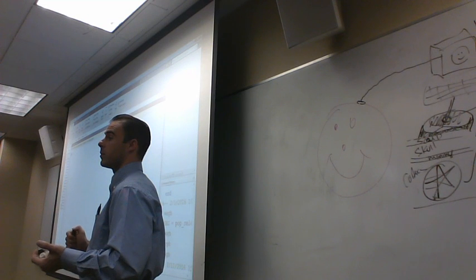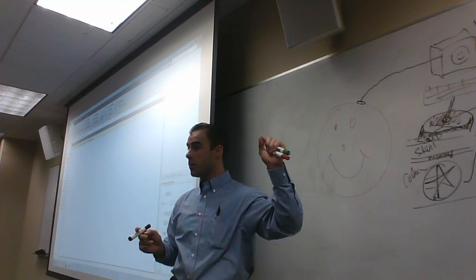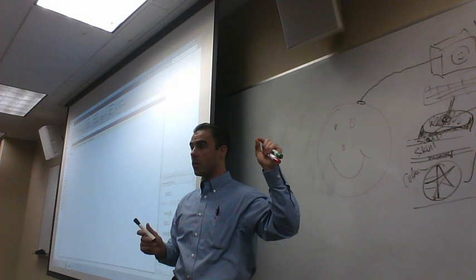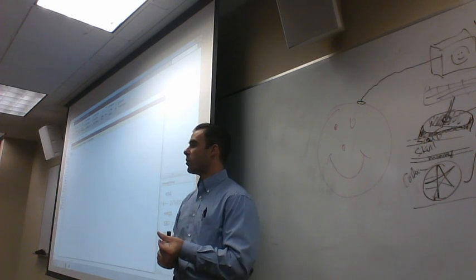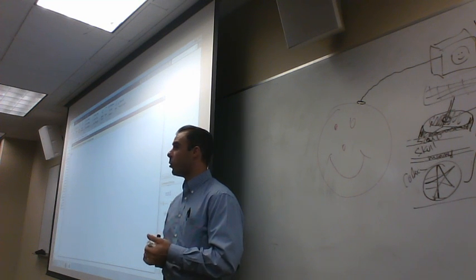You can filter it, right? So we do a high-pass filter to get rid of basically a linear detrend, to get rid of some of the drift or skin potentials. We talked about other ways we can filter the data. We said a little bit about low-pass filtering.